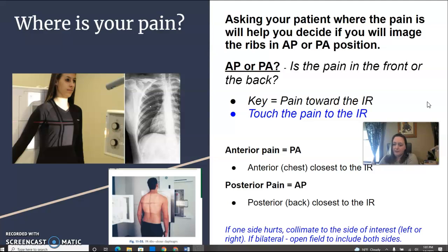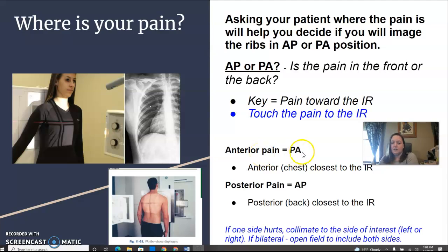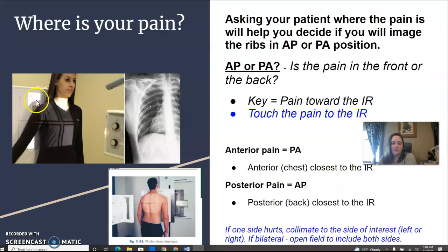Because the pain is going to touch your image receptor. So pain towards the IR — if they have anterior pain, or pain in the front, you're going to position your patient PA, so the anterior chest is going to be closest to the IR. If they have pain in the back, or posterior pain, they're going to stand AP, like she is here, with their back against the IR.